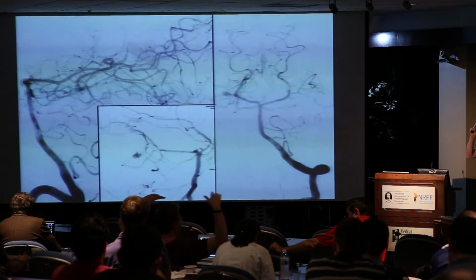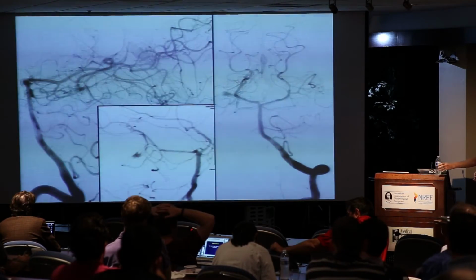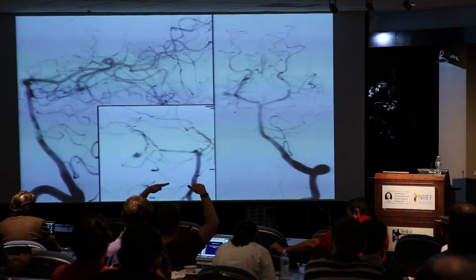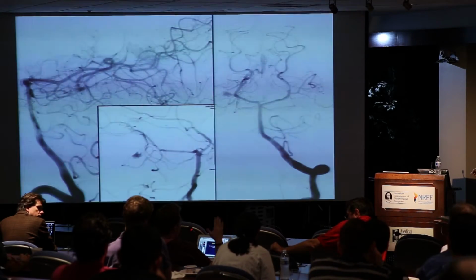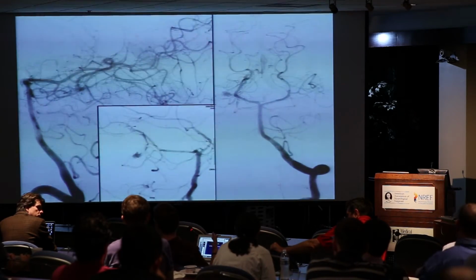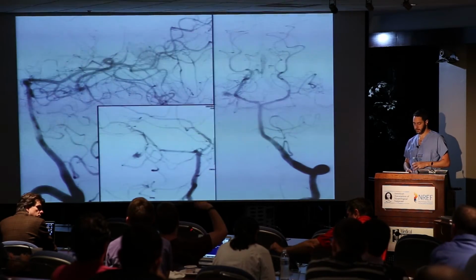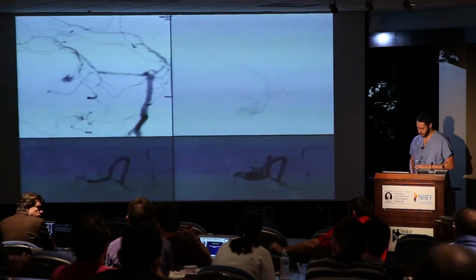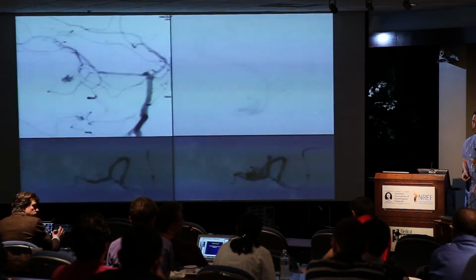I'm interested to hear about the other 5, because I've now done about 6 of them. And for a reason that I don't get, I've actually lost the comfortability of building the plug. I've done one spinal where I built it, it was the 3-centimeter one, and I pulled it at the top. But for the interventional ones, 5 of them, not one of them has broken. And I have photos and fluoroscopic videos of me having it under super traction, the marker clearly away, and pulling a lot and not popping. So now I don't feel comfortable enough to build a plug big enough to try that again because I was so disheartened by that prior experience.